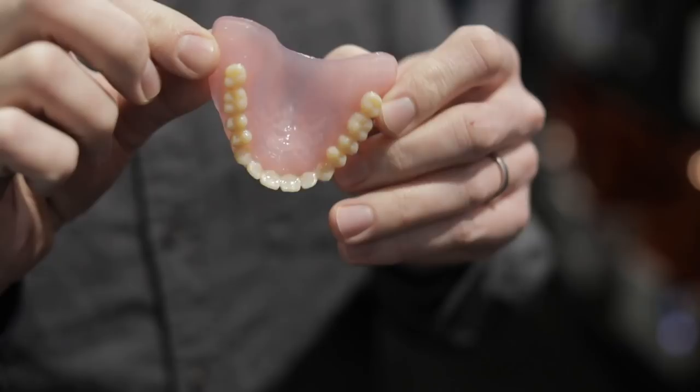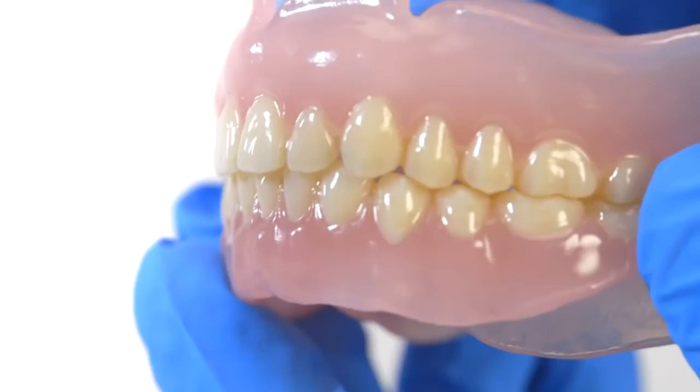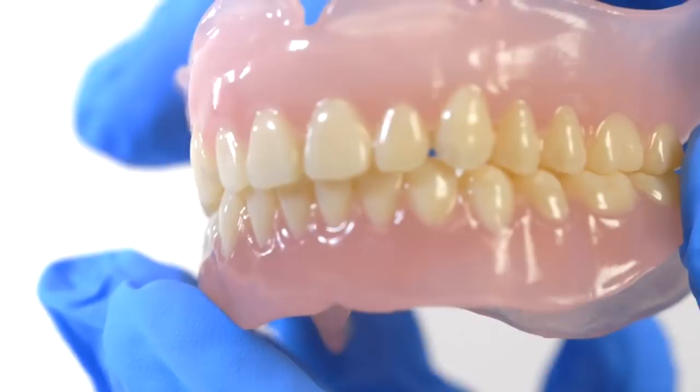For instance, we have a digital denture material. This is a 3D printed denture. The dentist scans your mouth, designs a denture in software, and then 3D prints it from two different materials — a gum material and a tooth material — and they can be assembled. This is something that until very recently was kind of an artisanal process.